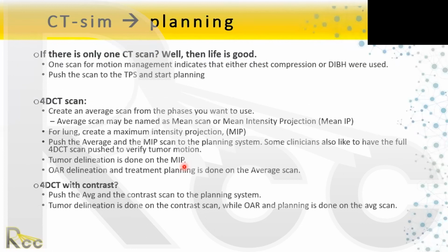Again, Sure. Sahar, you have questions, go ahead, please. Yeah, just first question, Dr. Shada answered. It's about minimum intensity projection. So I think it is useless. I didn't see any. It is useless.